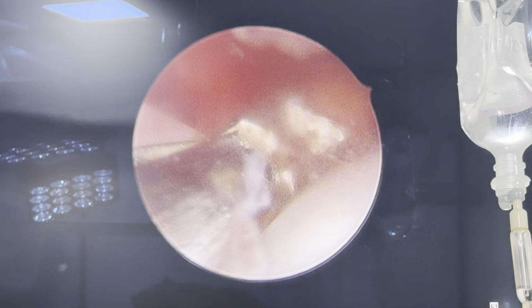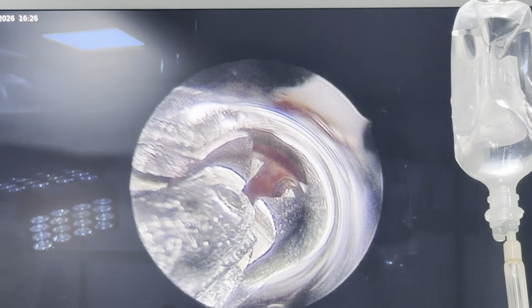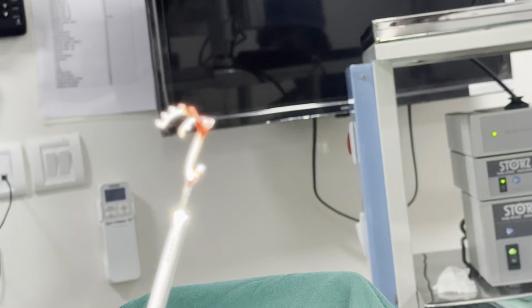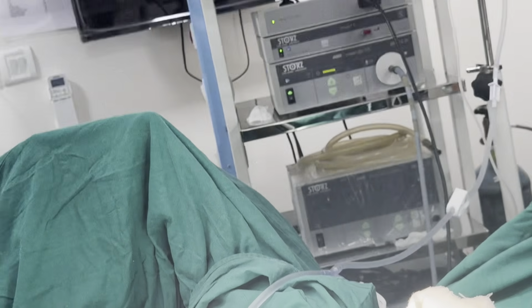Some IUCDs may snap at this point or there might already be multiple pieces inside, so repeated attempts of removing all the parts may be required. In this case, we were lucky that after the initial entry into the cervix, everything was pretty smooth. As you can see, the entire IUCD has come intact.